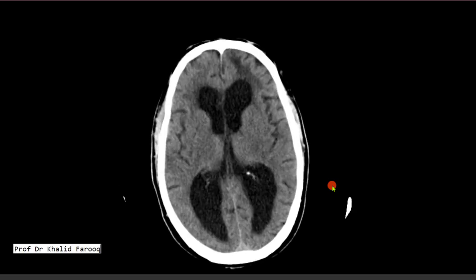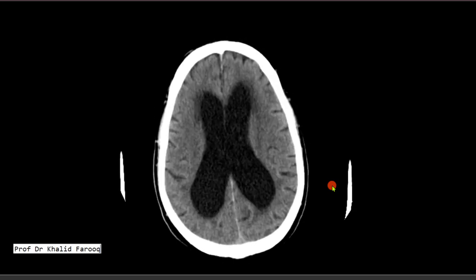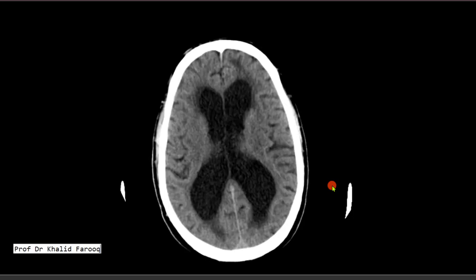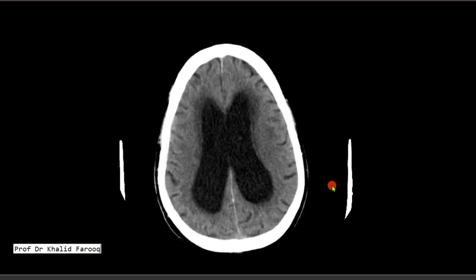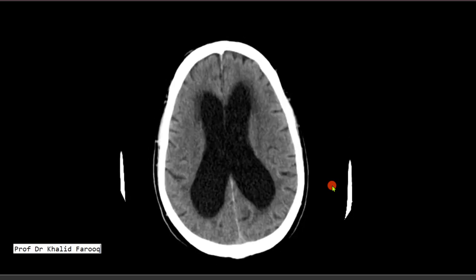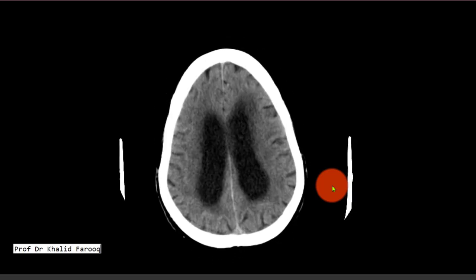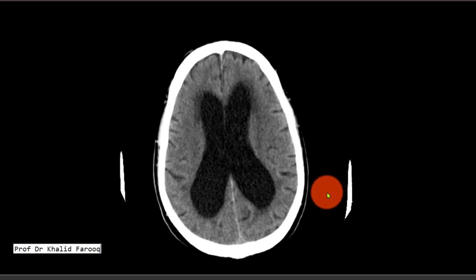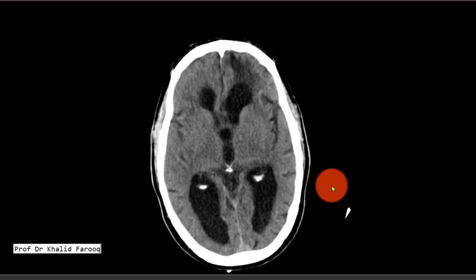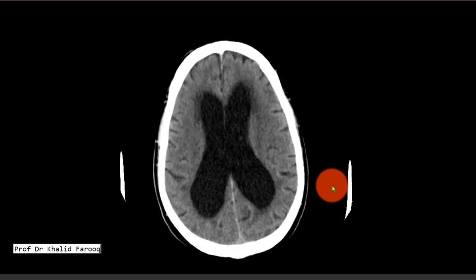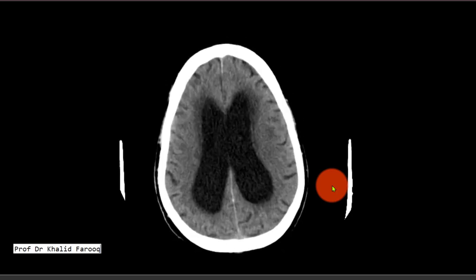We are discussing CT examination of the brain. This is a 75-year-old male patient who presented to us with urinary and cognitive impairment with gait disturbance. He presented with urinary urgency as well as incontinence.